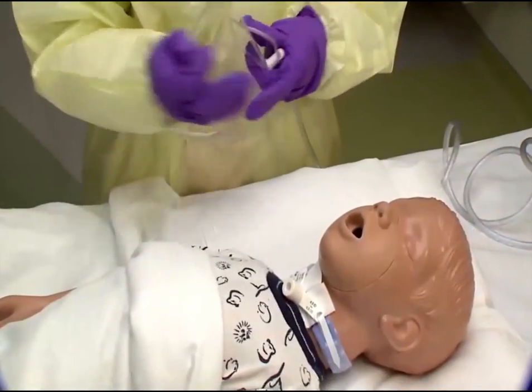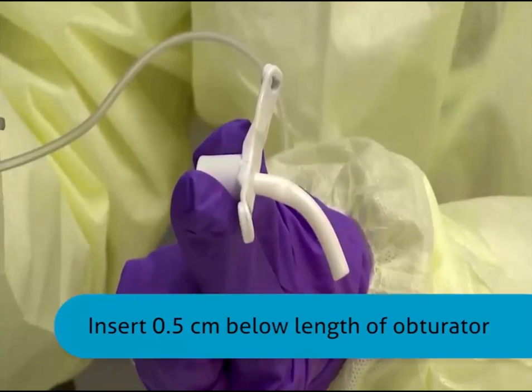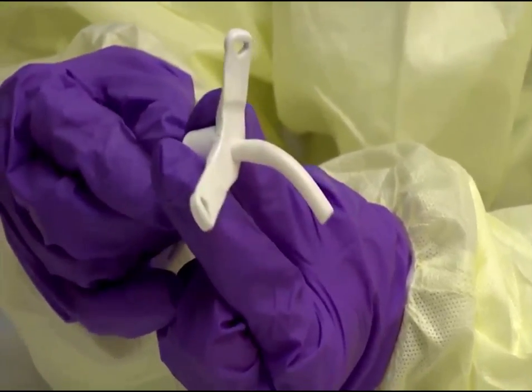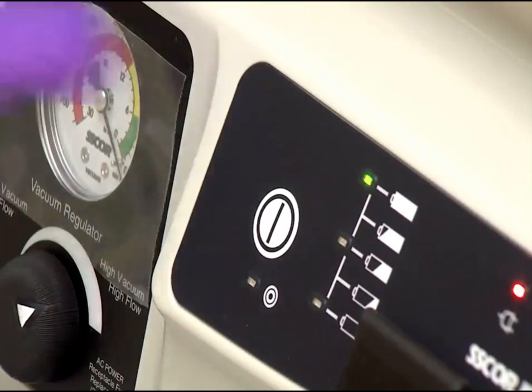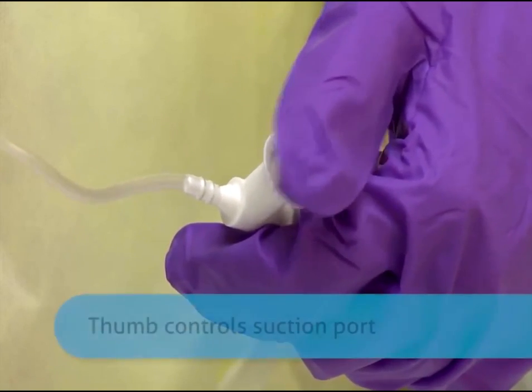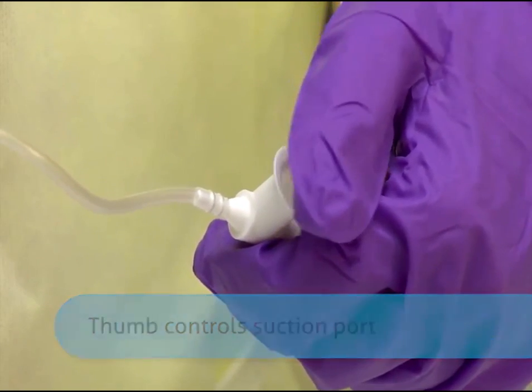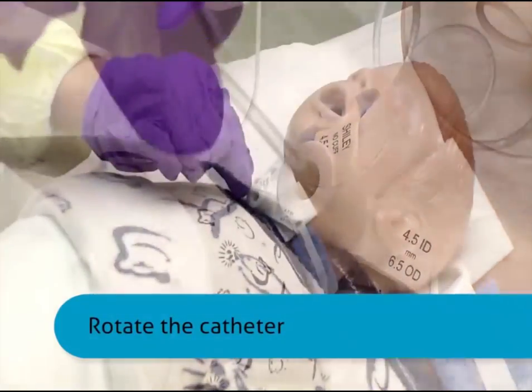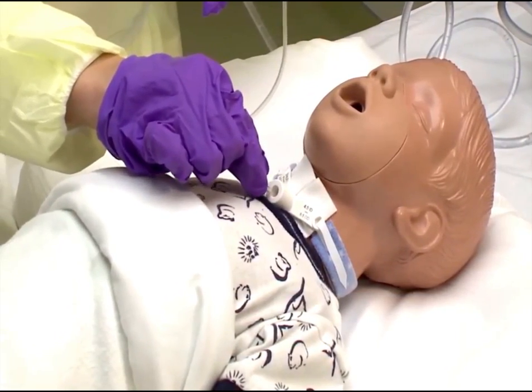With your sterile gloved hand, insert the catheter only up to half a centimeter below the tip of the tracheostomy tube. This can be measured against the trach obturator at bedside. Do not force if an obstruction is encountered. Apply intermittent suction by quickly opening and closing the suction port. Withdraw the catheter using a rotating motion. The entire suctioning pass should not exceed three to four seconds in duration.